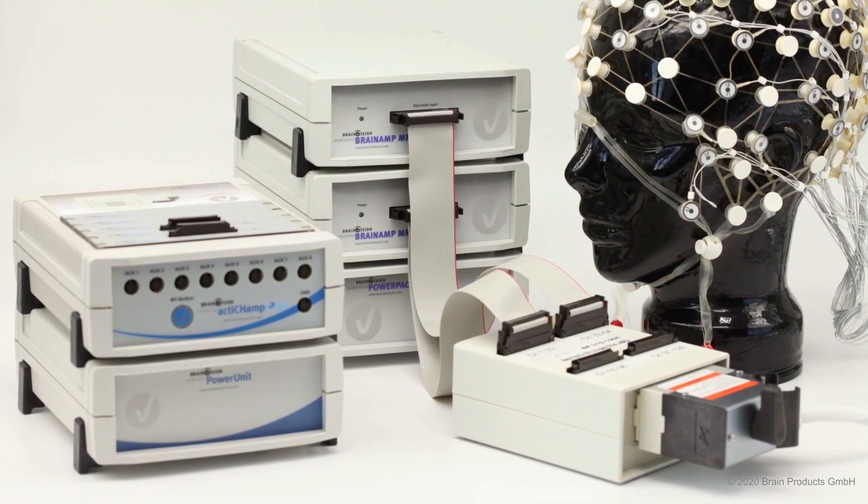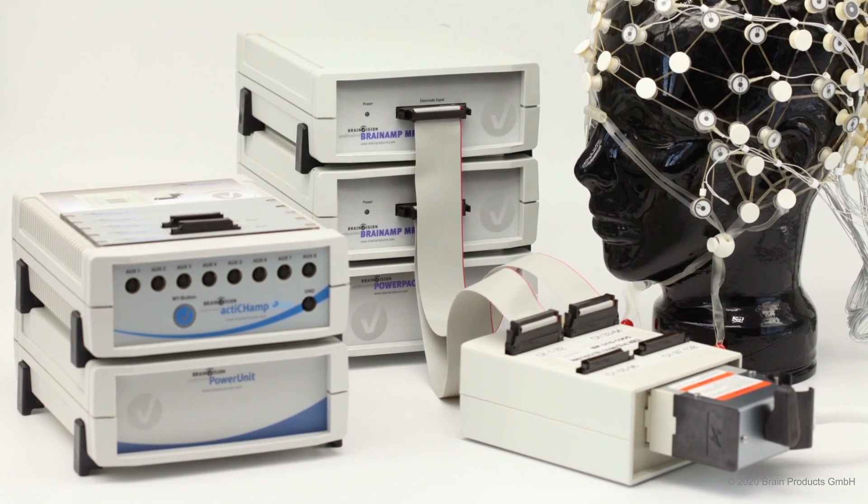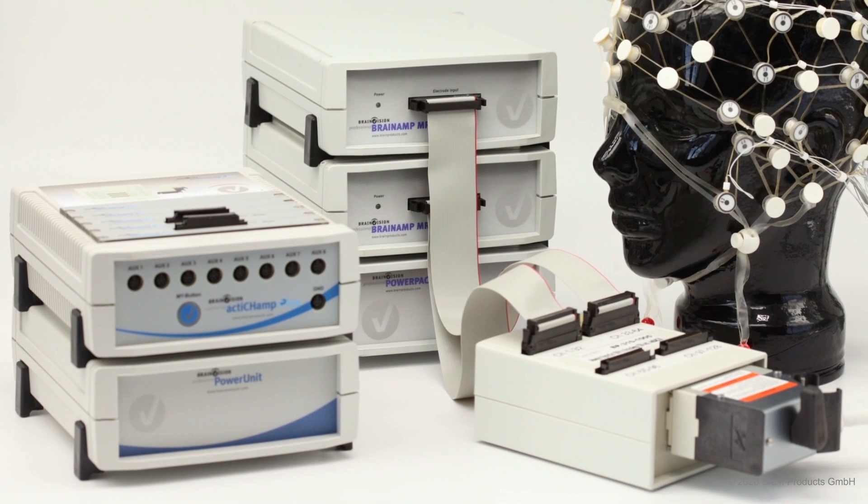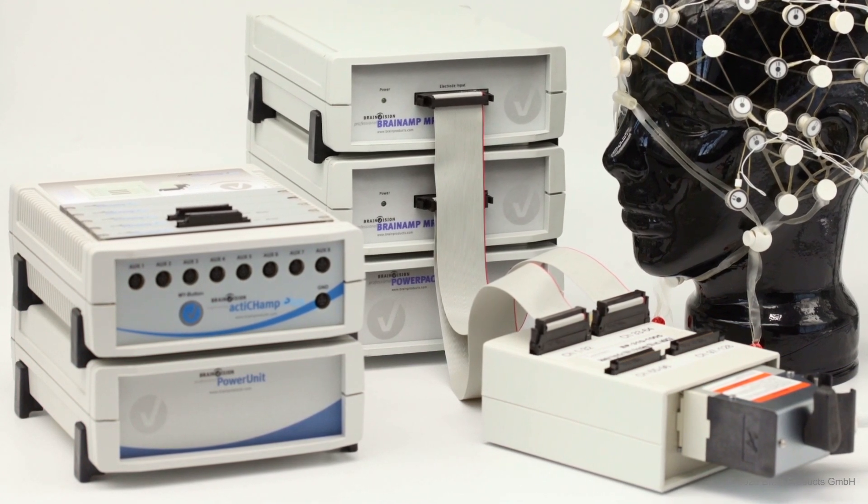Additionally, we can provide you with adapters to combine up to 128 channels HydroCel GSN nets with our actiCHamp Plus and BrainAmp family amplifiers.